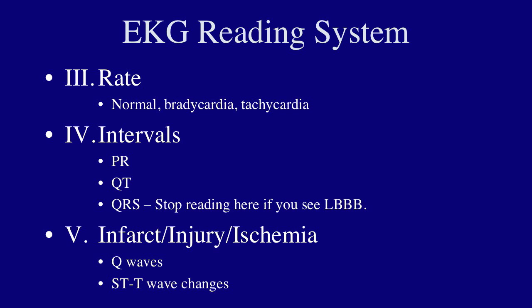You would do everything up until this point, and then you would say, left bundle branch block is present, therefore I cannot do further interpretation. Stop at that point. If you're looking at another EKG that doesn't have left bundle branch block, like page 10 in the course pack, you'll see that the intervals are normal looking, and left bundle branch block is absent, so you can continue the reading to step 5.